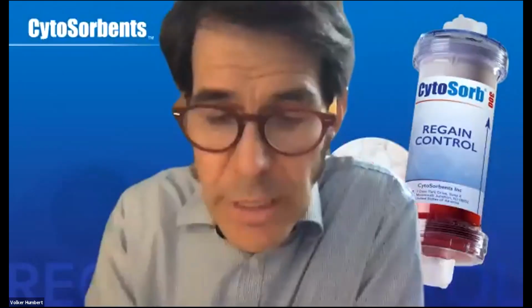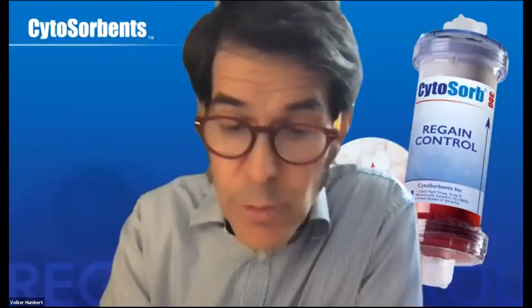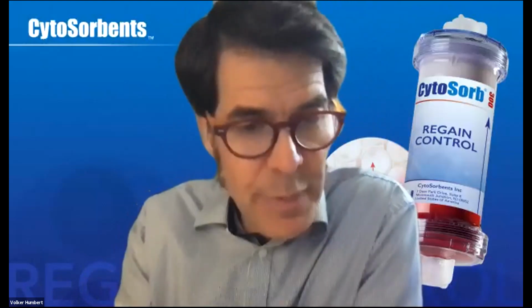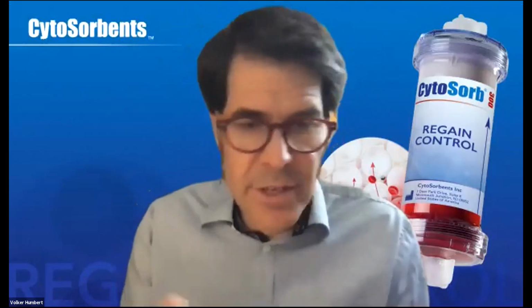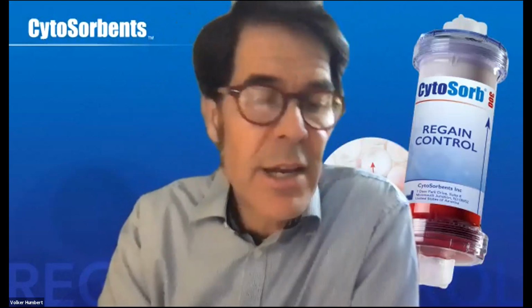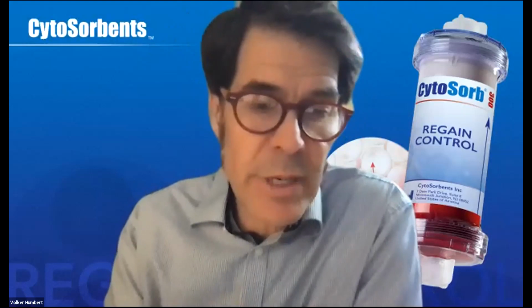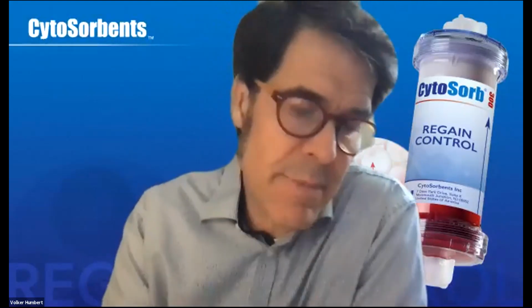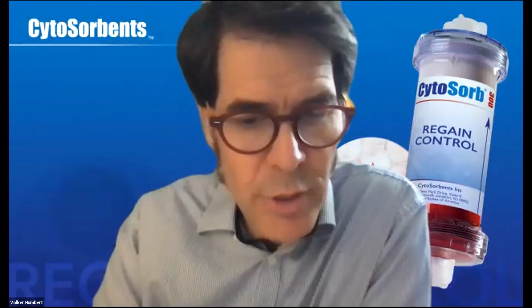Yeah, I will do. So, very important questions. Of course, it's also very important whether or not to continue Cytosorb therapy. In endocarditis we have current discussions, and it seems that in some patients you might make things even better when you continue with Cytosorb. You already make a very good impact, to all we know, with the pure intraoperative use, but you might make it even better when you continue postoperatively.